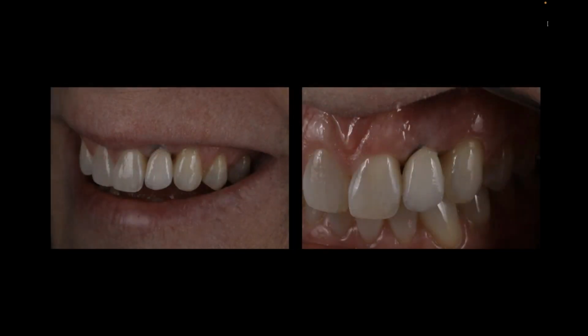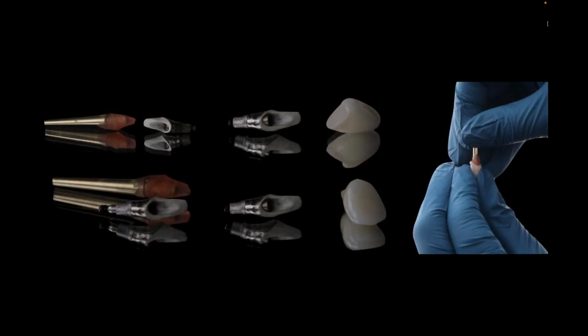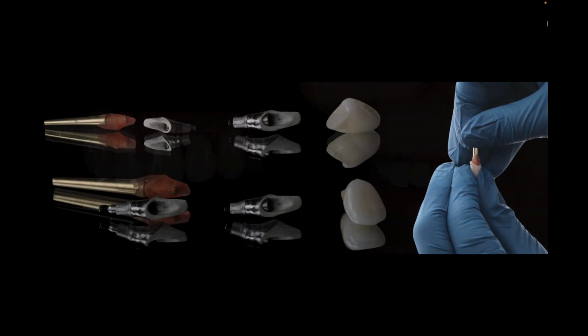make our final coping. So this was on the try-in, obviously, and you can see that the margin placement was wrong, the coloration was a little bit off, no problem. That'll come back to the lab, we make a new jig, we adjust the abutment to where we want it to be, and transfer all that information back to the doctor for the final insert.